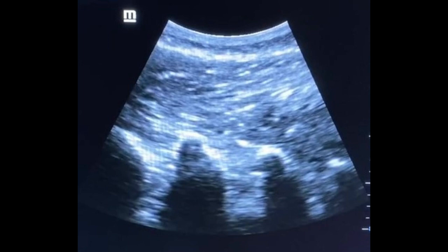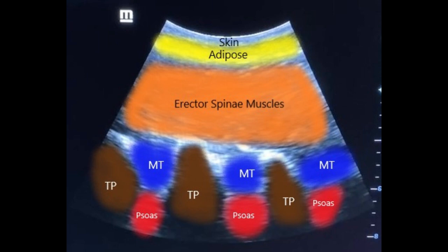Here's a still image of that ultrasound scan. Those three little mountains you see are the transverse processes of the vertebrae. In between those transverse processes, towards the bottom, is the psoas. On top of the psoas is the multifidi, and then the erector spinae is all the tissue on top. In the colored image: skin, adipose tissue, erector spinae in orange, three brown spots for the transverse processes. The blue things are the multifidi muscles, and then deep to the multifidi — directly in between the transverse processes, anterior to the multifidi — is your psoas muscle. That's why you need ultrasound: to see those transverse processes and go through the multifidi into the psoas.